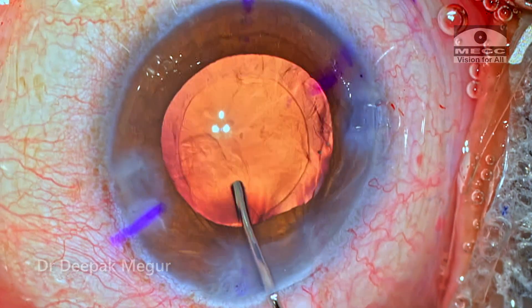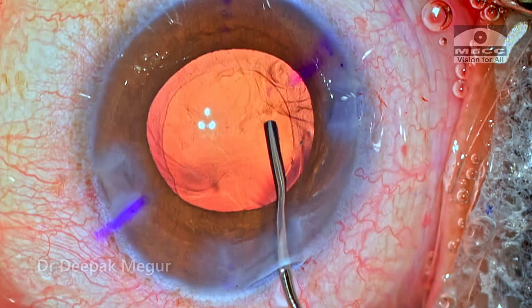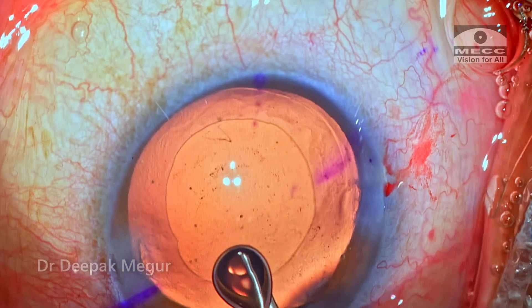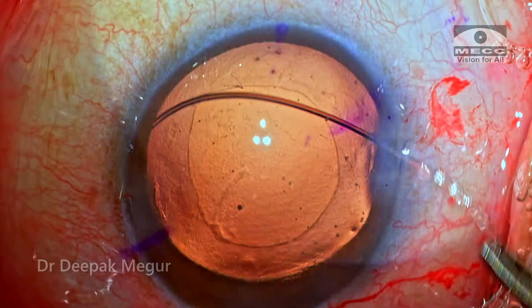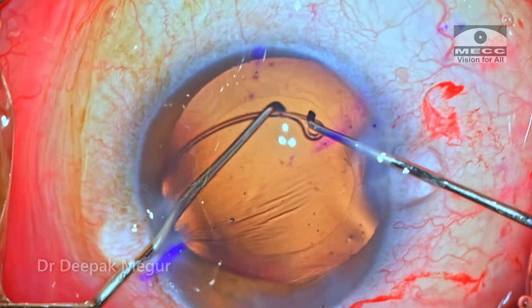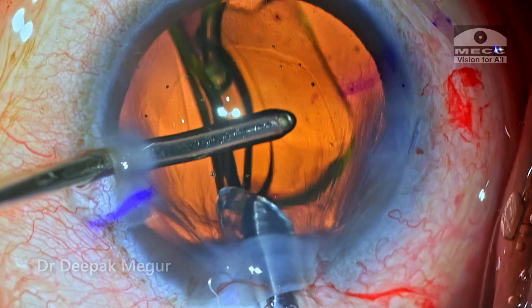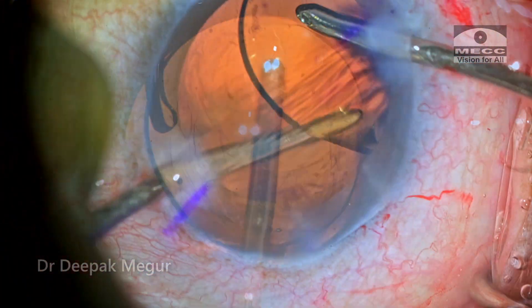Once the cortex is aspirated, the bag looks to be very clean. This is a patient who is having pathological myopia, and as a standard for all myopic eyes whose axial length is more than 24 mm and where I am using a toric lens, I make it a point to use the CTR. The bag is inflated, the CTR is being implanted into the capsular bag, followed by the IOL implantation. OVD both in front of and behind the lens is then being aspirated out.